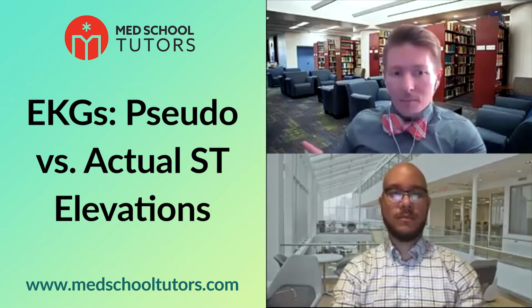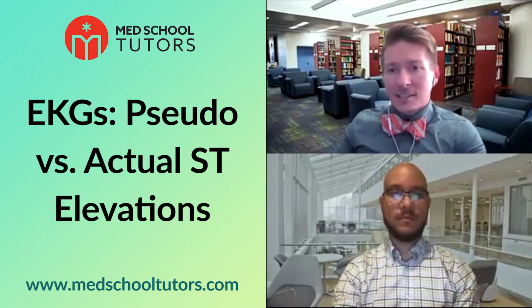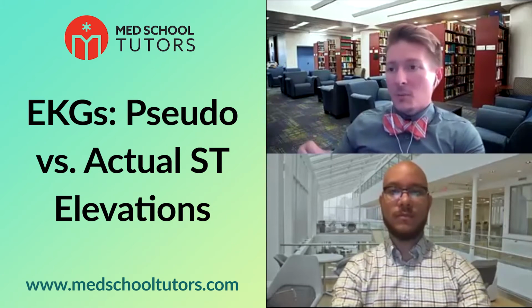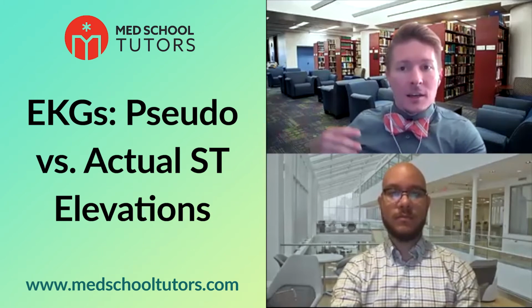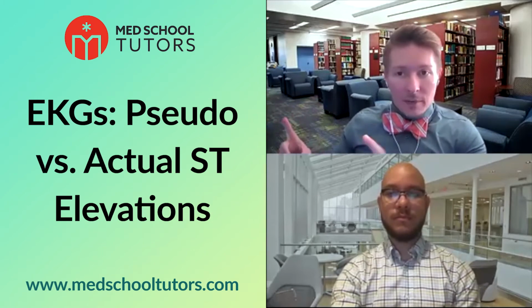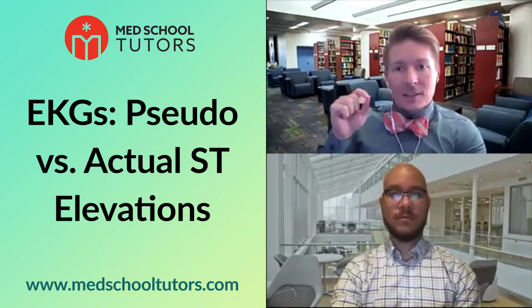That being said, I do want to emphasize that ST segment elevations happen for 3 separate reasons on the USMLE or level exams. The first one is the one we've discussed, which is current myocardial ischemia and myocardial infarction. However, myocardial infarctions are usually limited to specific leads on the EKG.